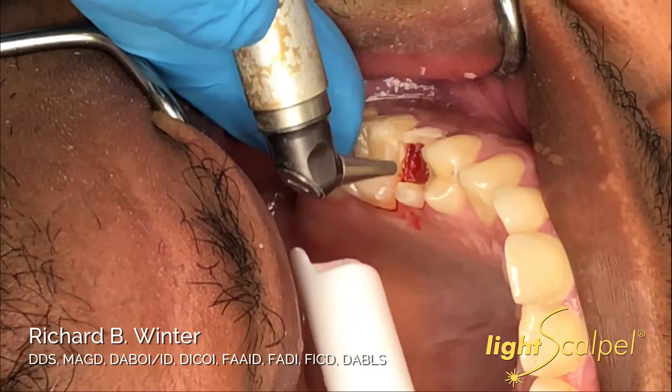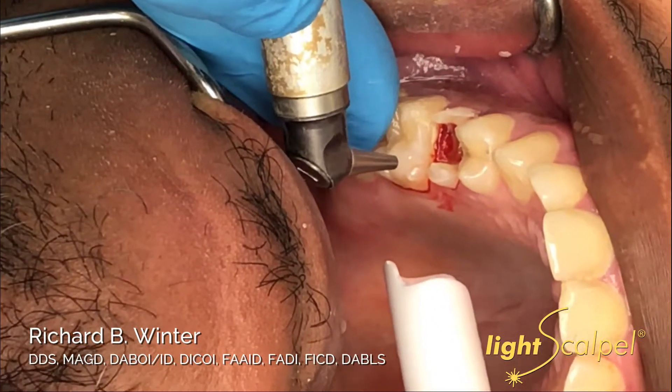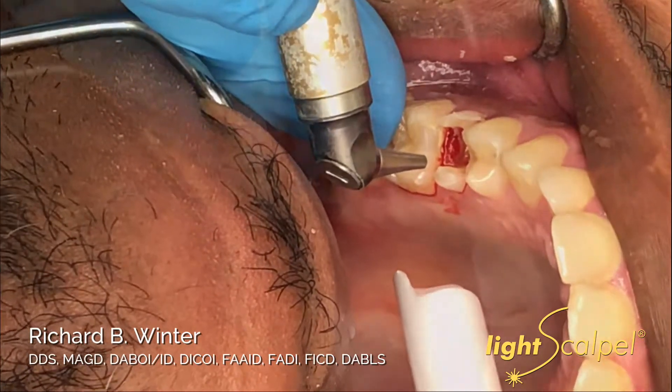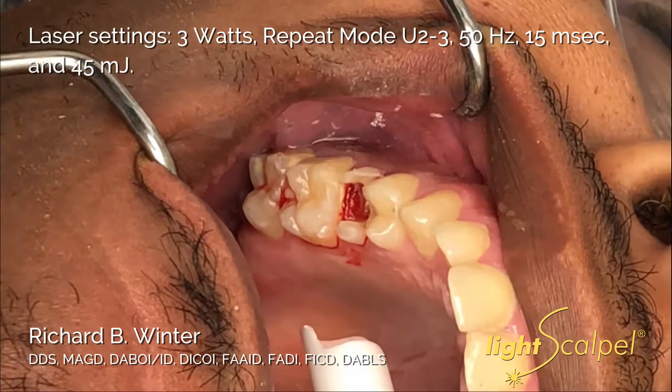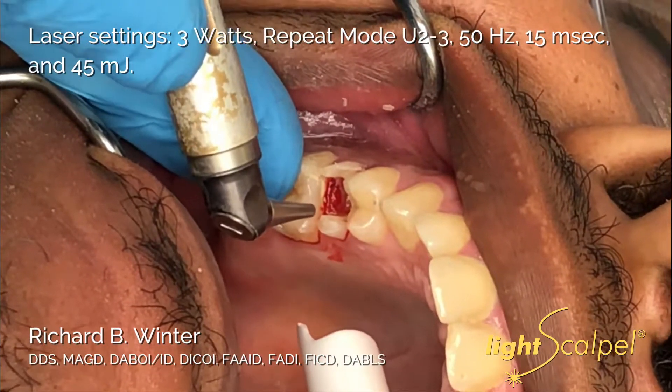We talked to the patient about how severely affected the tooth was. It's got a very, very long root, and we're going to try and do a modified minimal crown lengthening procedure to see if we can buy some time and save the tooth.